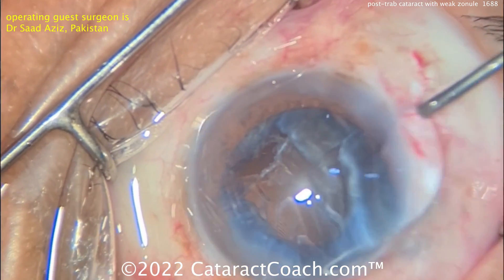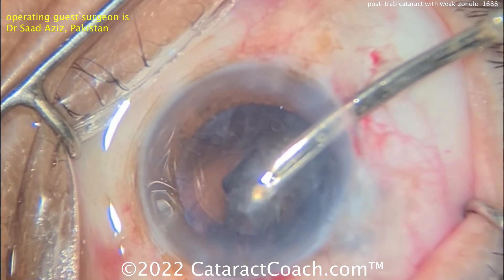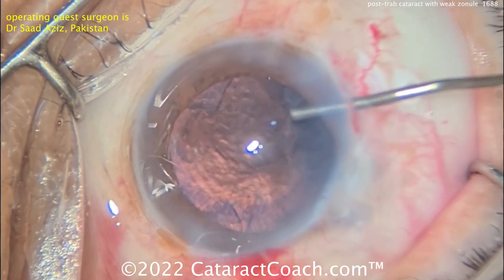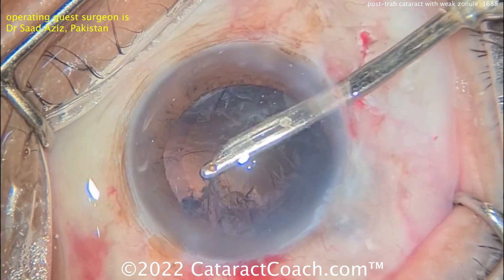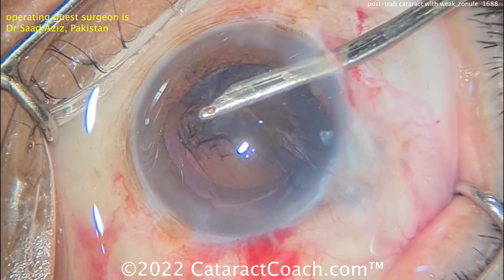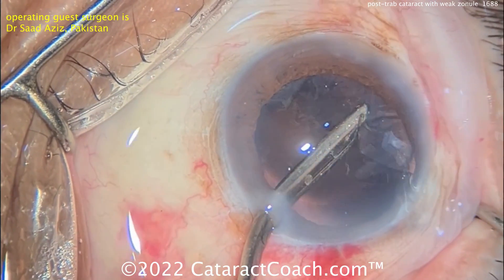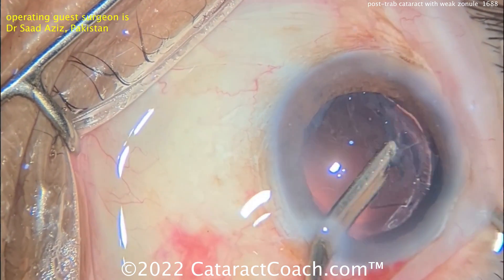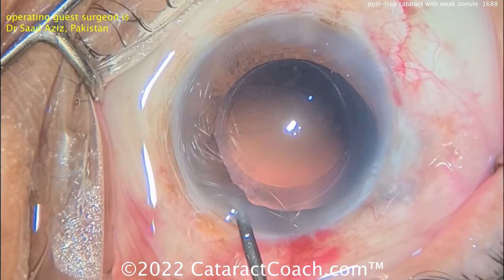I like this little extra coating of viscoelastic on the cornea as well as in the eye. Using a Simcoe cannula to get pieces mobilized — there's mostly lens cortex and some epinuclear shell that can be aspirated. Taking your time. It's looking like a pretty reasonable eye now. This looks like HPMC — hydroxypropylmethylcellulose — a very nice, inexpensive viscoelastic. Outside the U.S., it's literally $1 or $2 a tube; in the U.S. you'll be shocked — it's $50 a tube. Same with the trypan blue: in the USA about $66 for one tube, and in other countries $1 or $2, sometimes even less. Now cleaning up the lens cortex — as you pull it out, watch the rhexis edge. Make sure the rhexis doesn't move, and it does not. Notice it's a little more effort to remove the cortex because the CTR is holding the capsular bag in place.